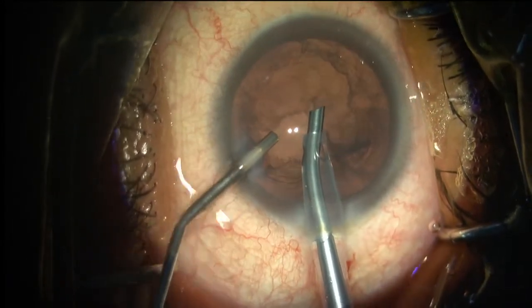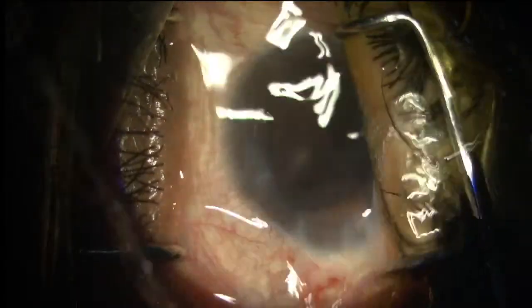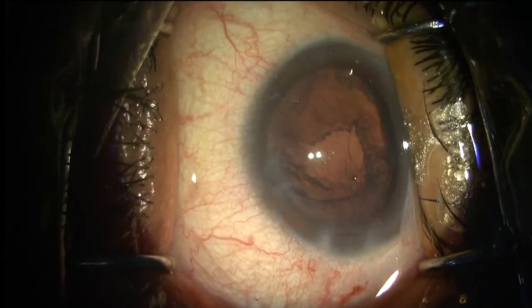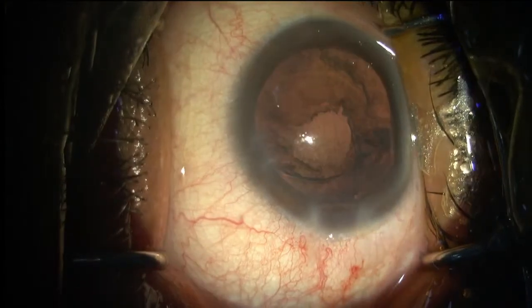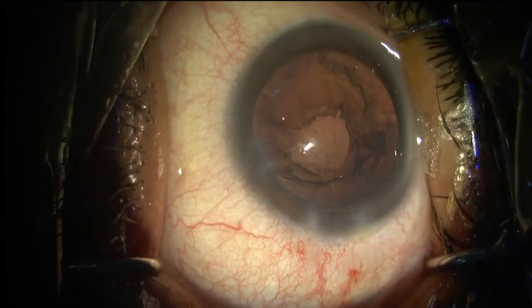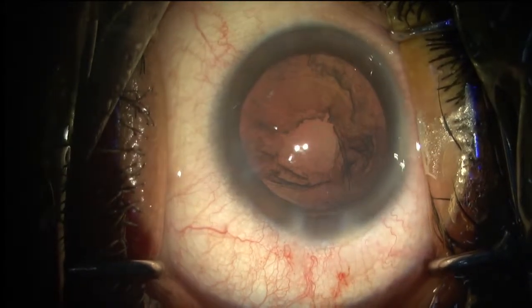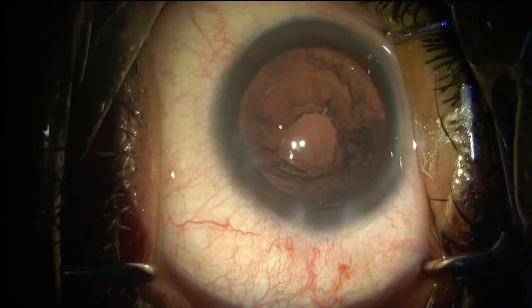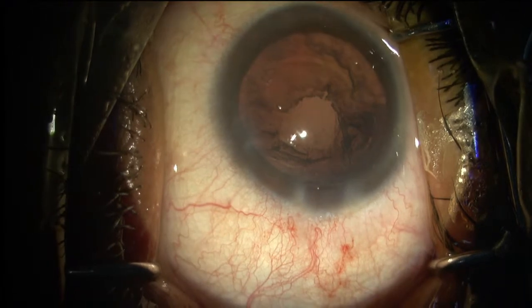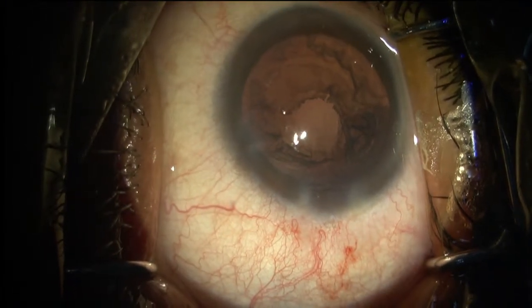So now I'm just putting in a viscoelastic before we're drying so that the chamber depth is always maintained. So that will prevent unnecessary vitreous disturbance and will decrease the ischemia and inflammation. So I do not allow the chamber to collapse at any stage of the surgery. So whenever my infusion comes out, I always put a viscoelastic inside the eye.